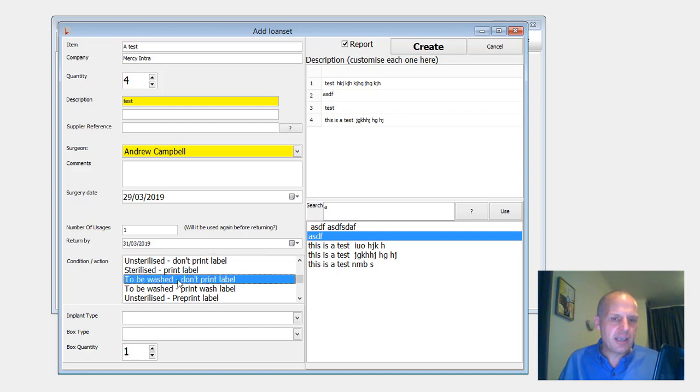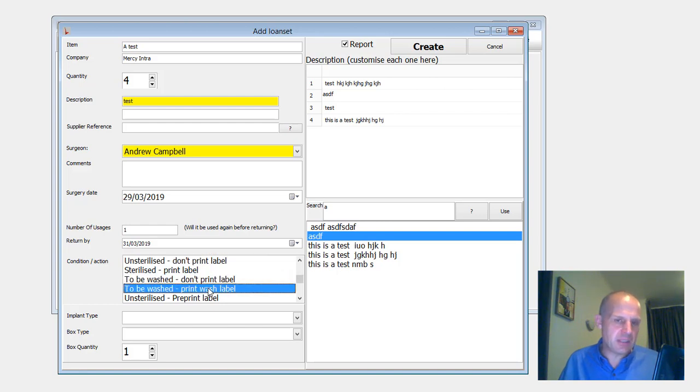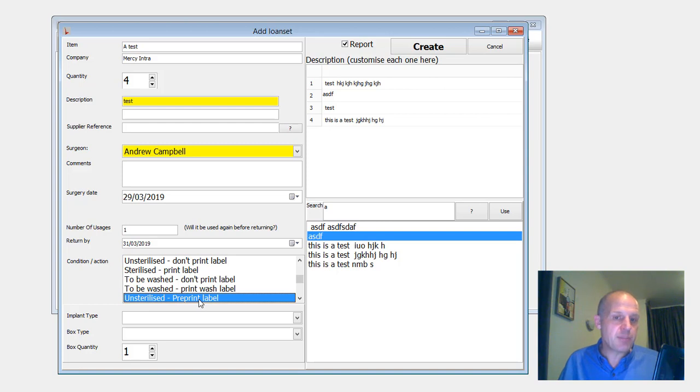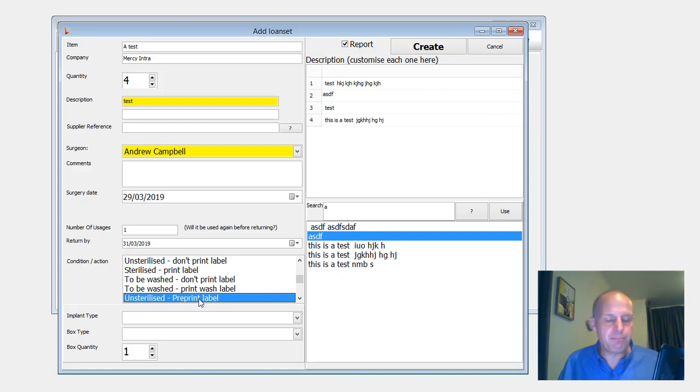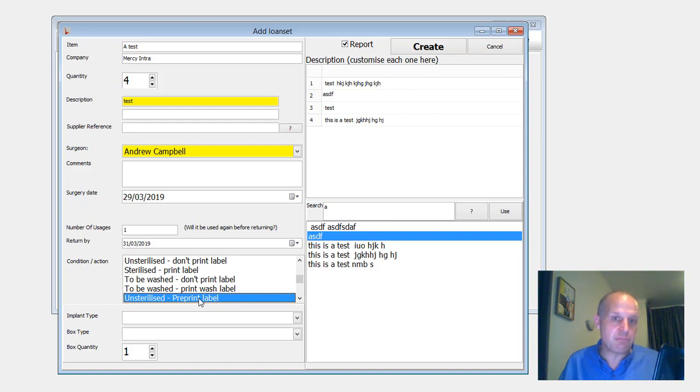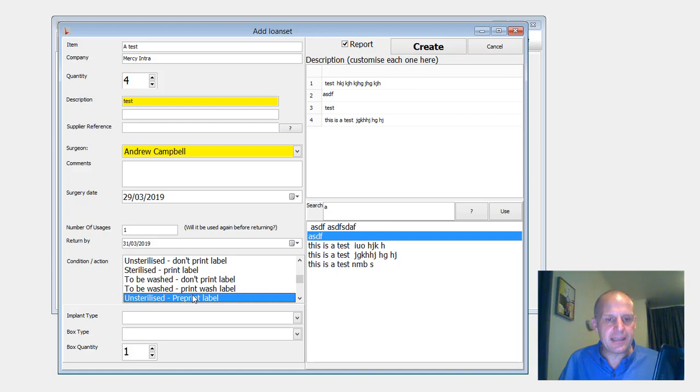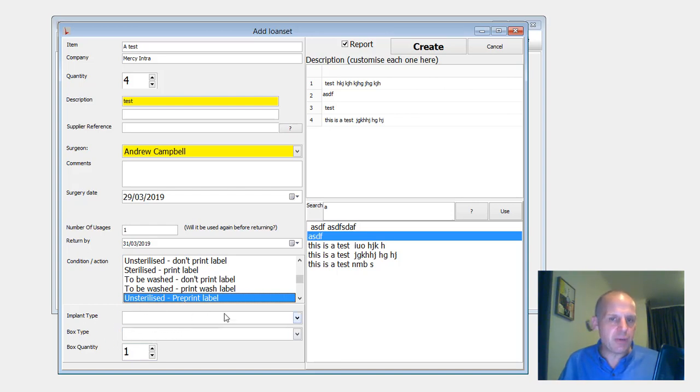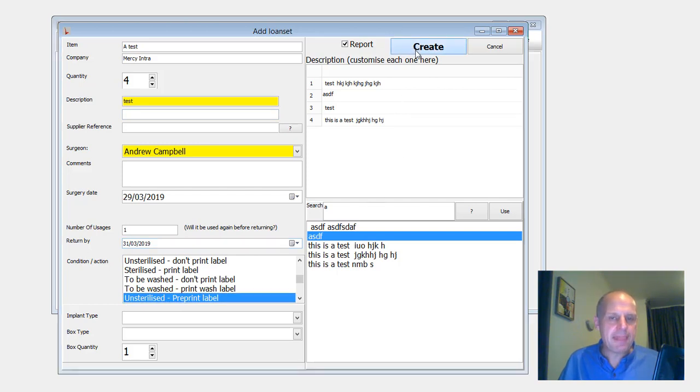Was it unsterilised? So don't print labels. For St George, it's to be washed and print the labels so that they can be scanned. Here's a new one, which is it's unsterilised, but I want you to preprint the labels so that the staff in the pack area don't have to do it. And that's the option that Mercy Ascot are going with. And they've just asked for a couple extra pieces of information to be recorded as well. But basically, that's what you need to enter.